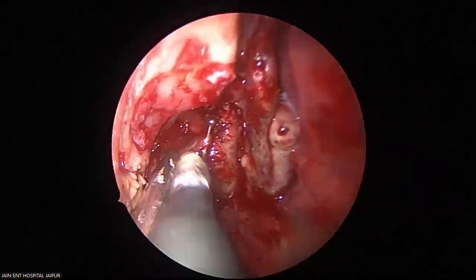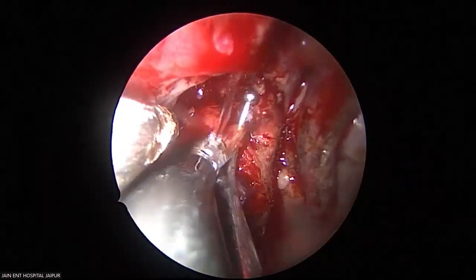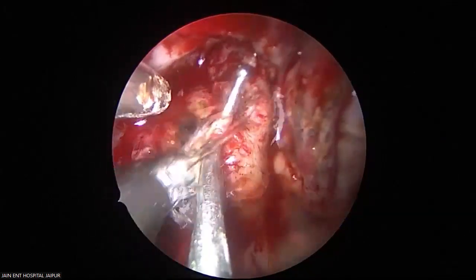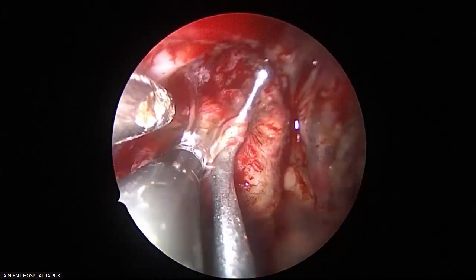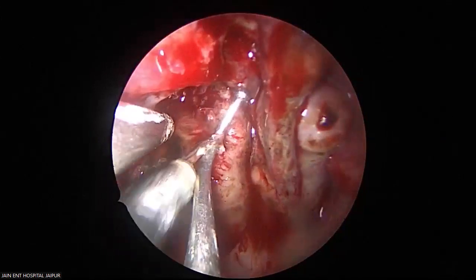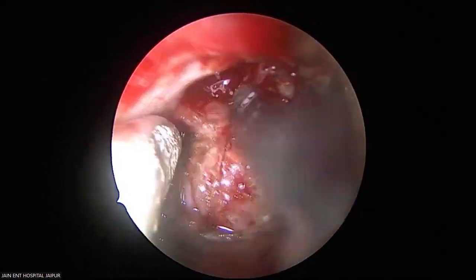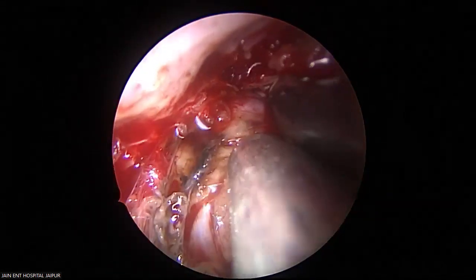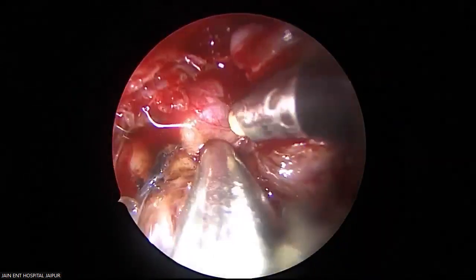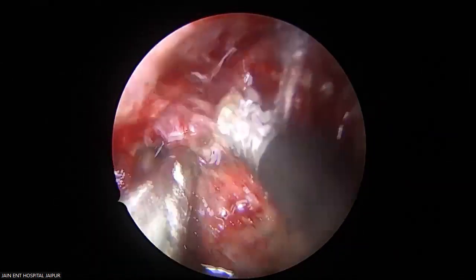What I will do... Can you see the main vessel behind? Yeah. That looks like the main IMA.